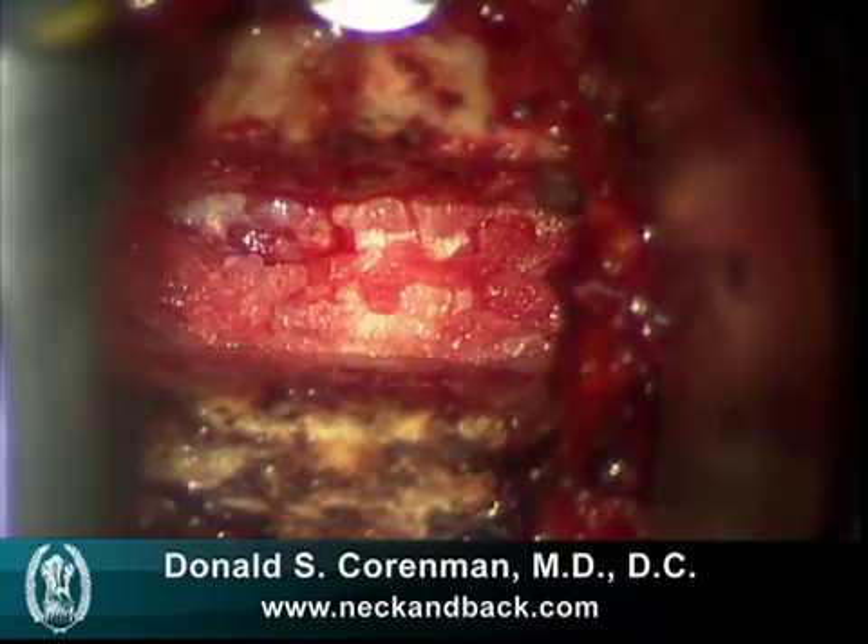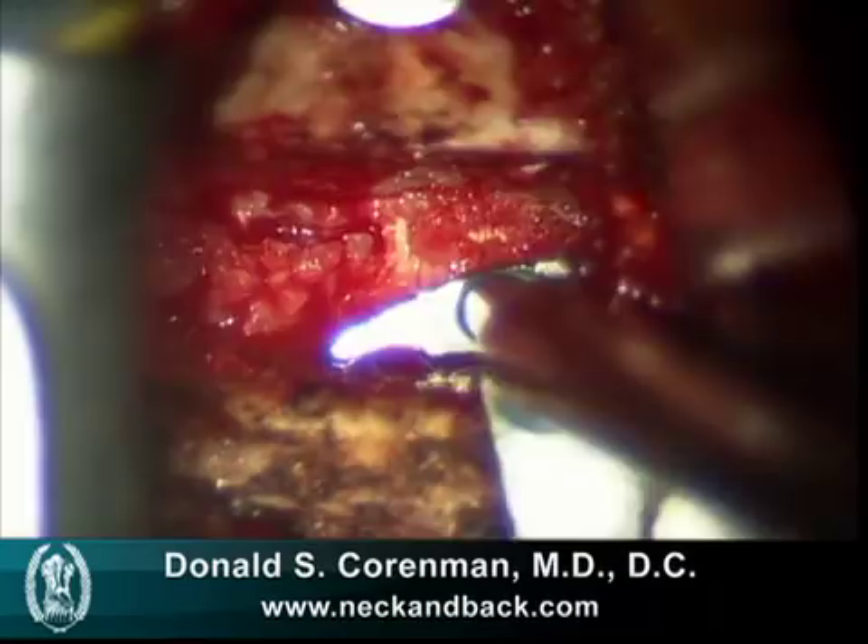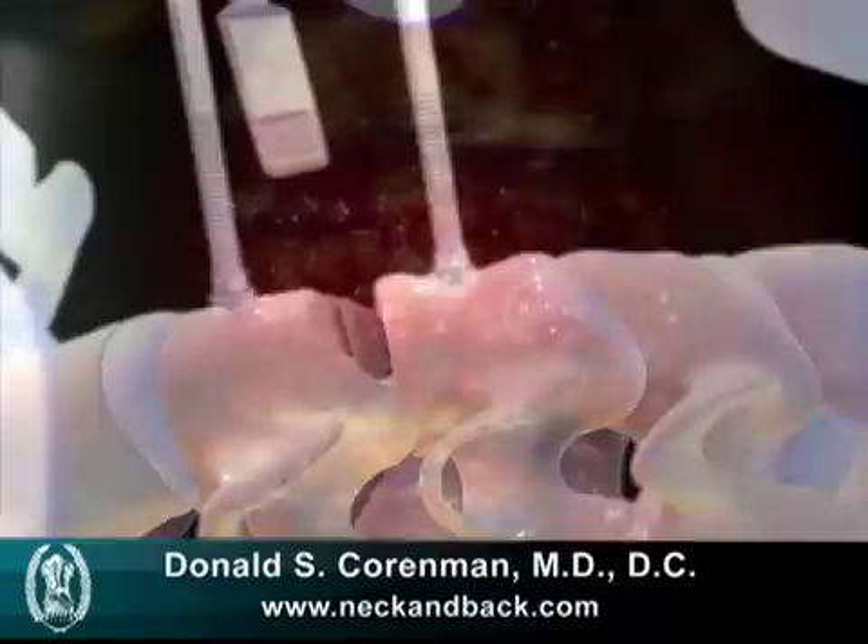We prepare the graft. It could be an autograft from the patient themselves, or an allograft. In this case, we'll use an autograft. This is a device that measures the depth of the hole, and then what we'll do is take a graft, as depicted in this animation, and place it between the two vertebra.